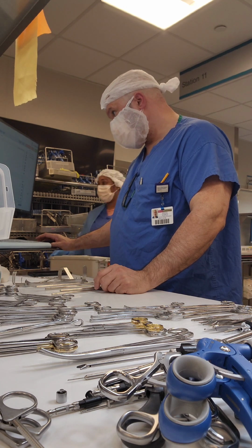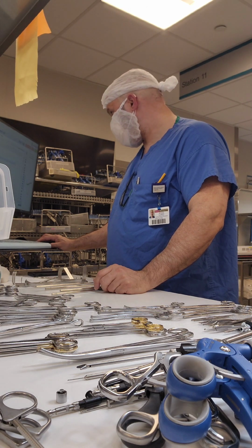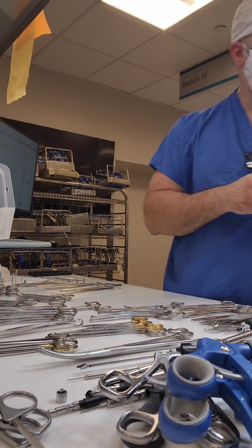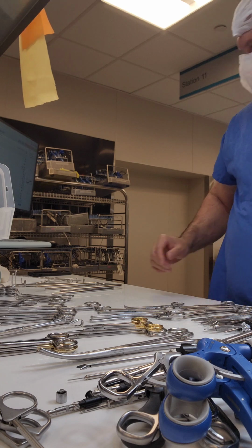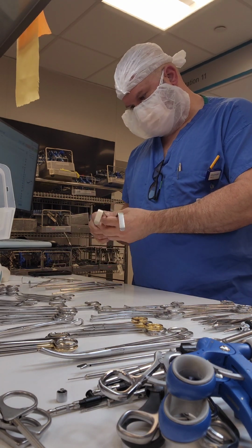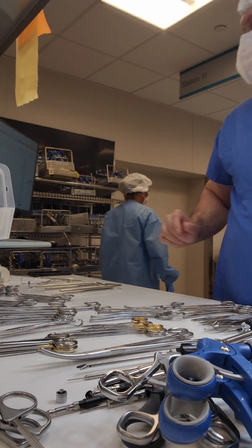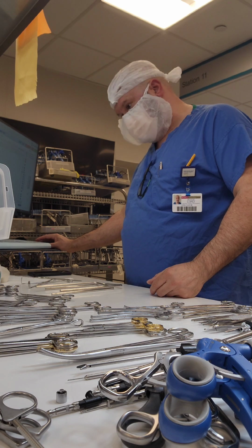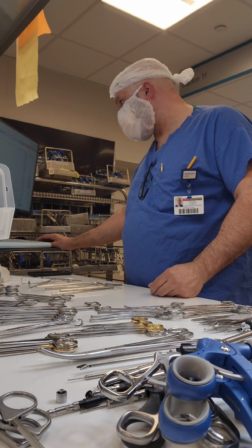and I don't do my trays from top to bottom. I actually look for instruments that I can identify very quickly. Like if I know I have to put retractors on the bottom of my basket, I look for those first and be able to identify them, right? So I see my retractors, I place that on the bottom of the basket, okay, give it a quick little inspection. Inspection doesn't have to be 2-3 minutes. It can be quick, especially with single metal retractors. Really quick look at what you're looking at.